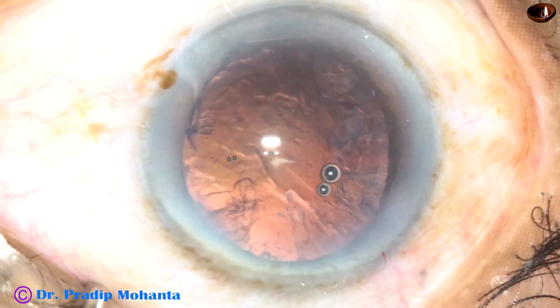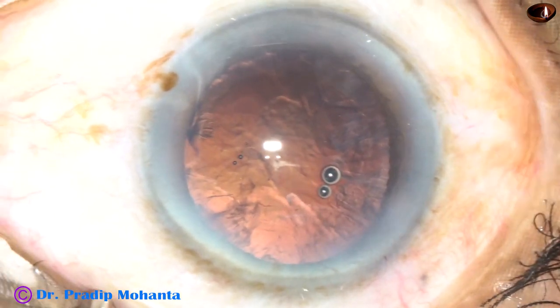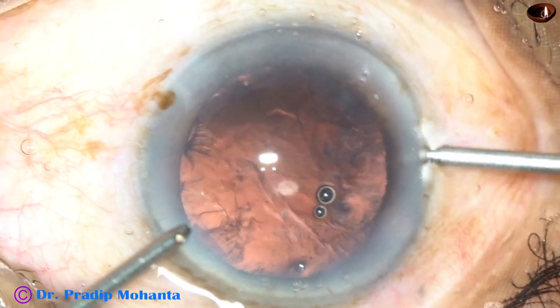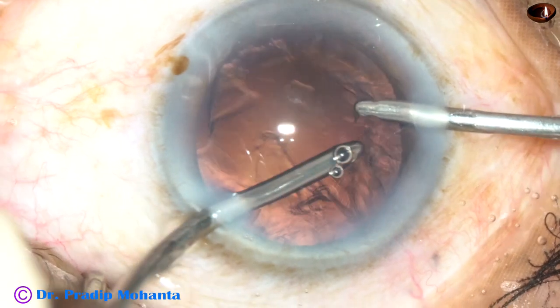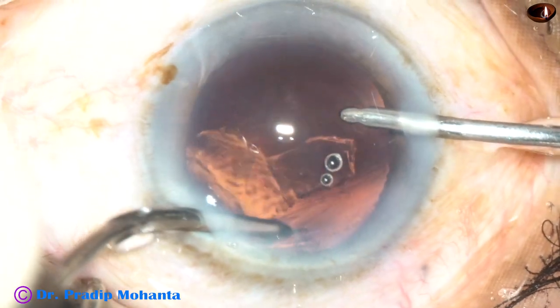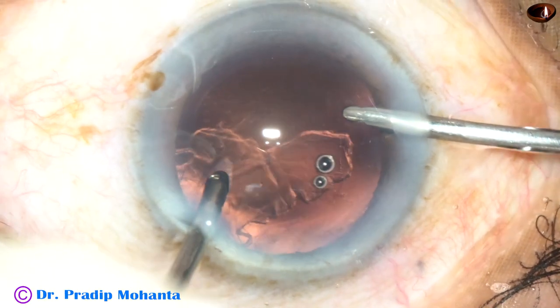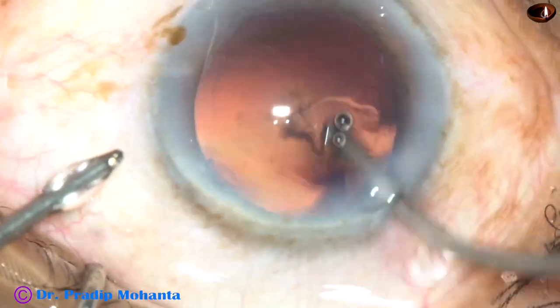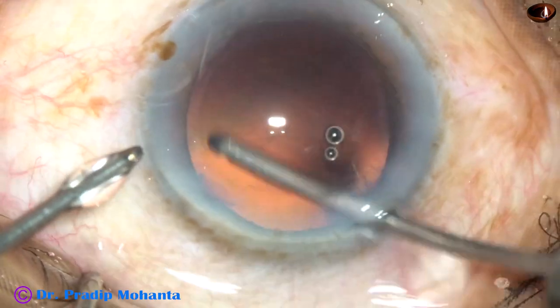Since the side ports are very small, Simcoe will not go through these side ports. So I am using bi-manual irrigation aspiration. It is very easy to remove cortex from all around by the bi-manual irrigation aspiration. Some cortex is sticking to the posterior capsule — it is displaced by fluid jet and then it comes out.